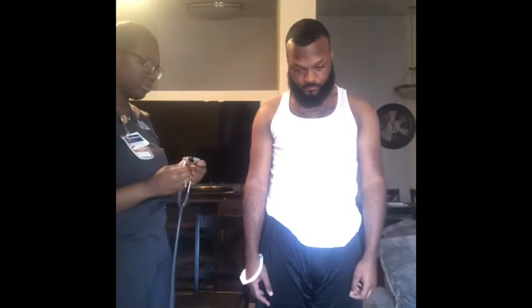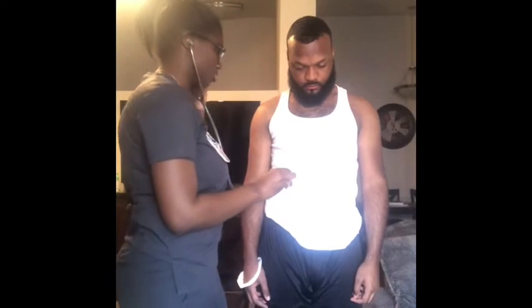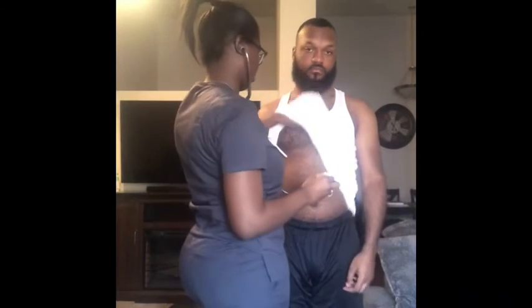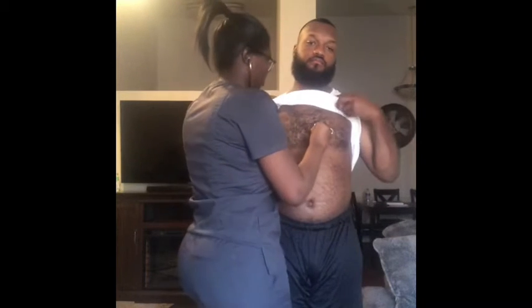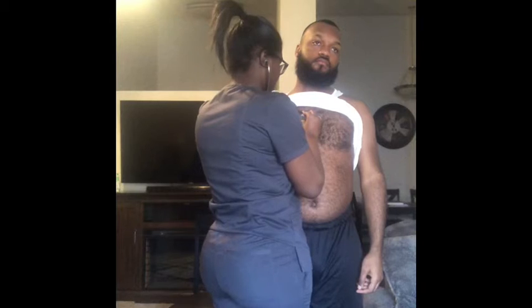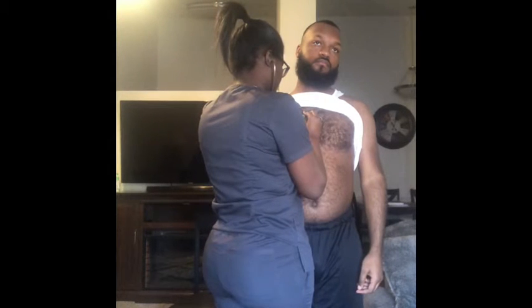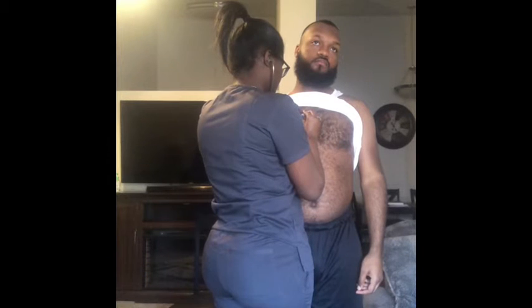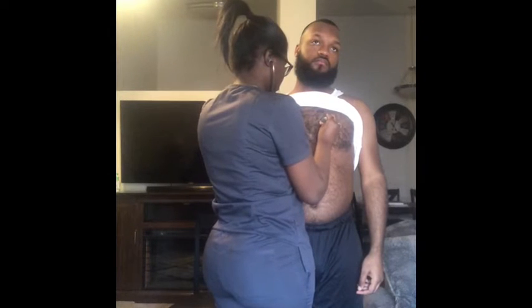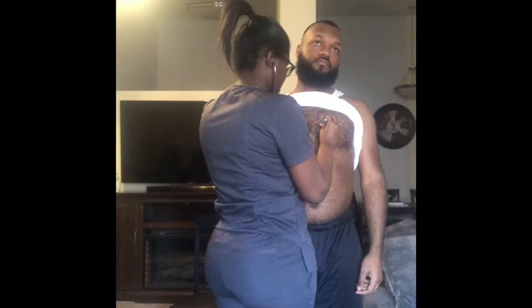And I'm going to listen to my patient using APETM. This is A, the aortic. Then the pulmonic.